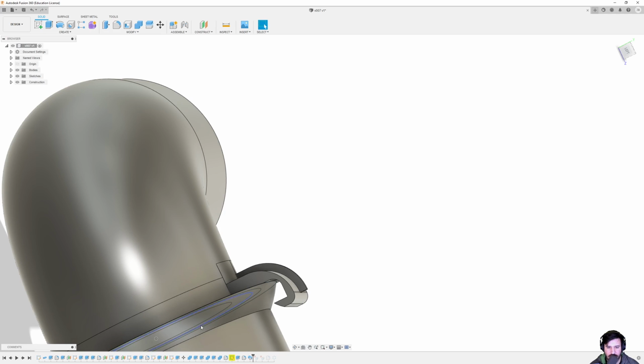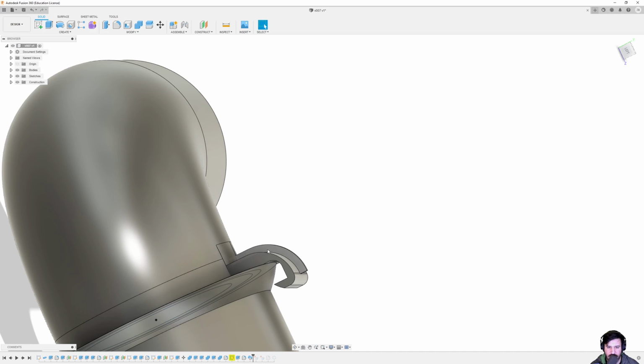What is this? The sweep. So this right here, like you saw how it started as a little piece right there, and then it gets swept following this arc right here. This arc that's in blue or black if I'm over it. It follows it up and over. This was more just to give it a little bit more strength. I don't know if I needed it. It ended up working with it, so I didn't really bother taking it out since it worked so well.